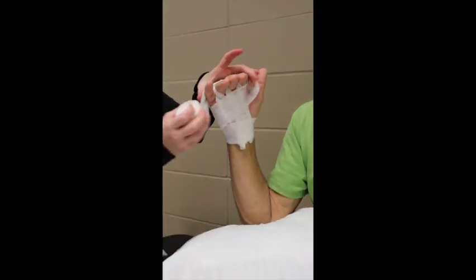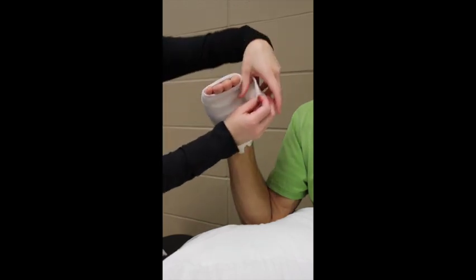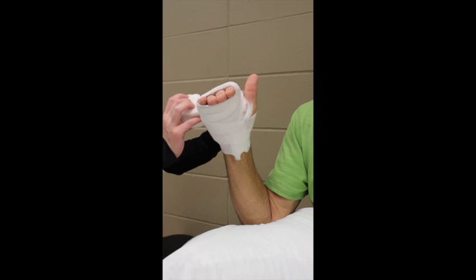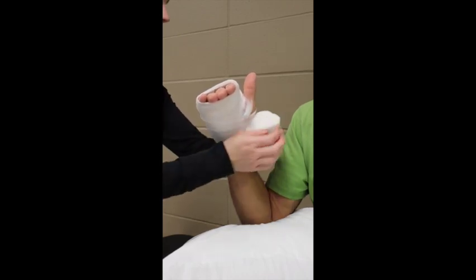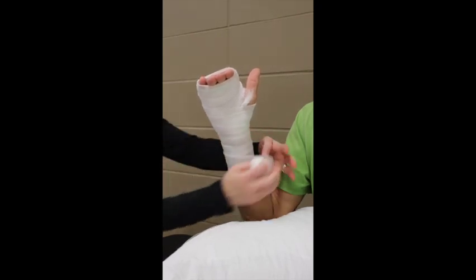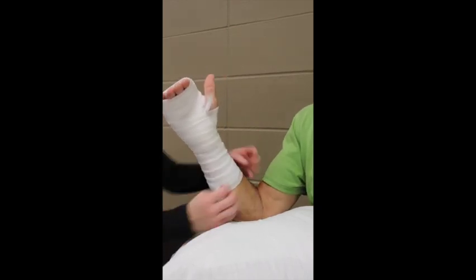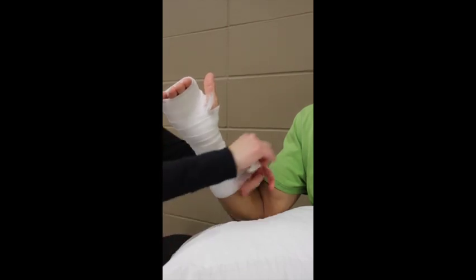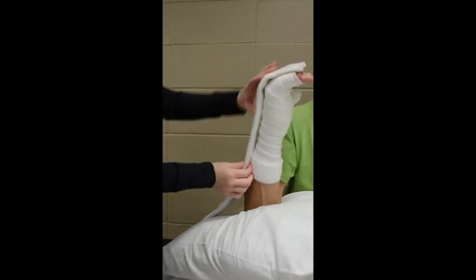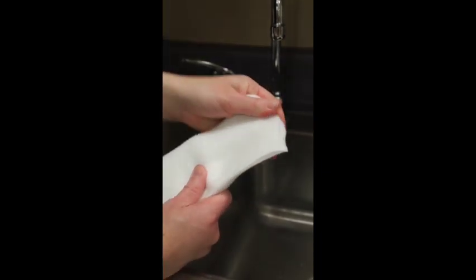Wrap around the hand, tearing through the first web space, then working up and around the fingers. Go around and around at the ends of the fingers. Tear again through that first web space and work proximally, overlapping by 50% so we have two layers of padding for most of the hand and wrist. There's a little more padding in the palm as that's where the injury is. You will also have used some non-stick gauze over the laceration. Lay down the padding without tension, and at the proximal end go around several times so there's good padding at the edge where the splint may rub. Now measure the splint on the dorsal hand and forearm, going from the fingertips all the way to the proximal edge just inside the padding. It's very important to pull the edges of the padding over the fiberglass at both ends before you get it wet.